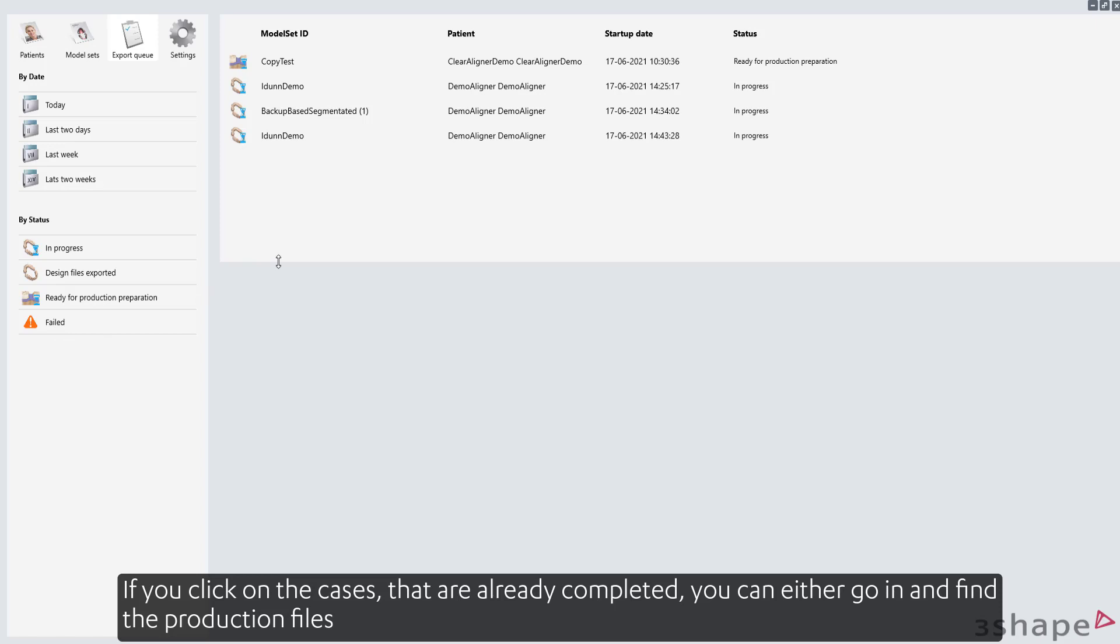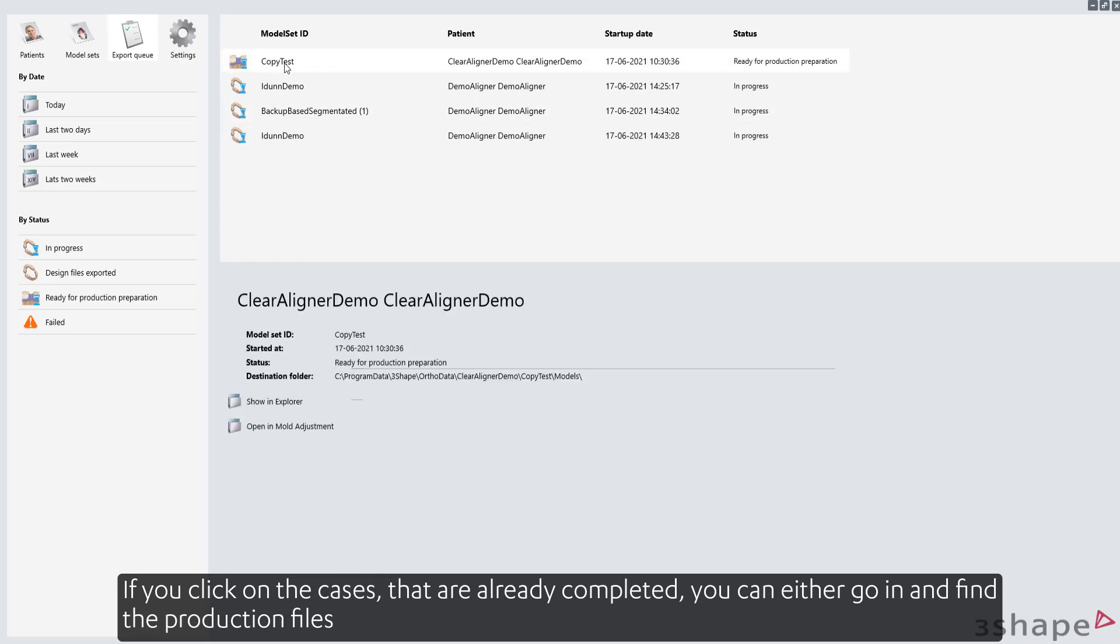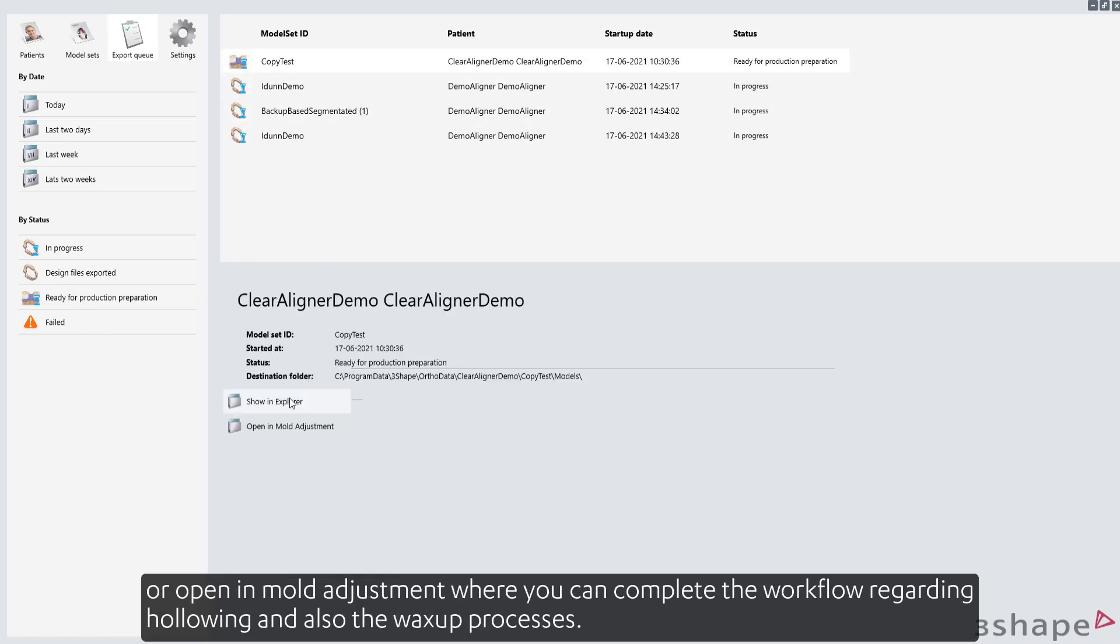If you click on the cases that are already completed, you can either go in and find the production files or open in Mold Adjustment, where you can complete the workflow regarding hollowing and also the wax-up processes.